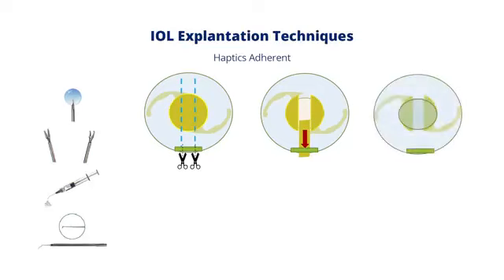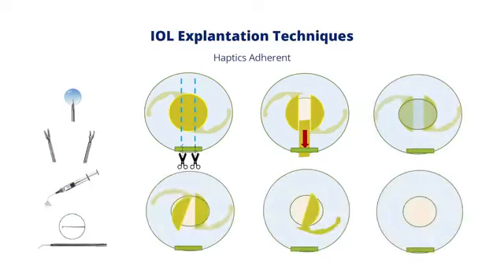And once you've done that, you'll realize there's a lot more space for you to maneuver the remnant parts of the intraocular lens. You can then take your time to use viscoelastic or forceps to dissect free the haptic without stressing the capsular rim and the zonules. And step by step, you can remove the other pieces.